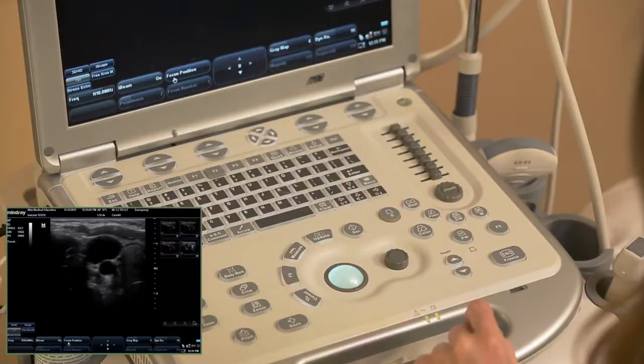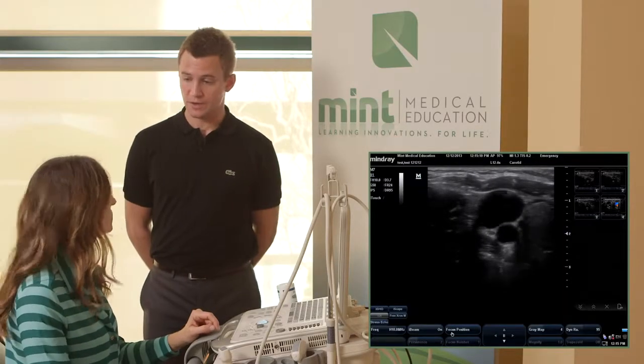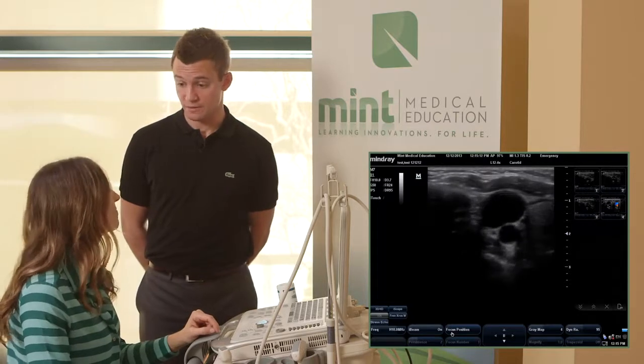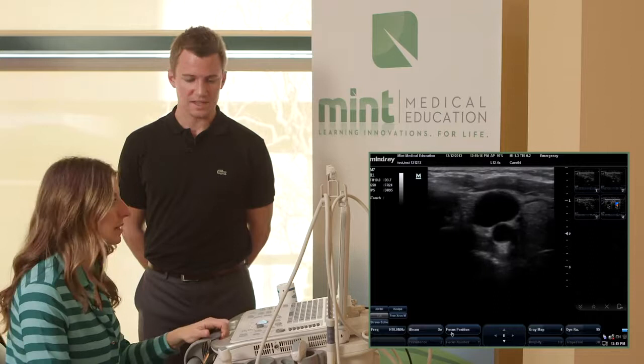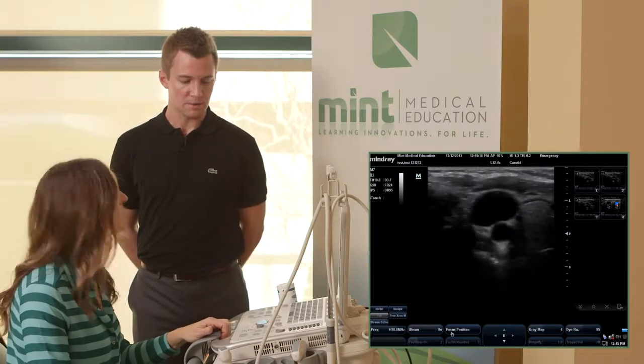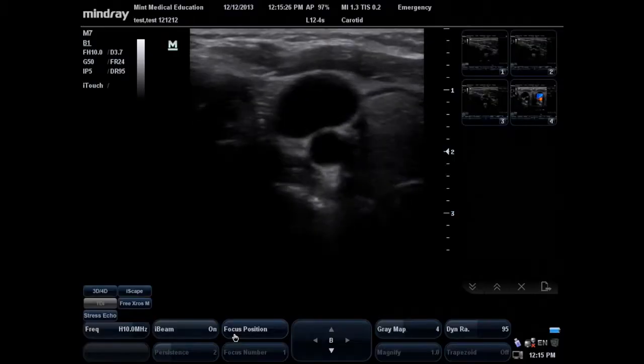Okay. And it's important to note that your power Doppler on the M7 is a very good tool for picking up sensitive low flow states. Right. Or deep, like a distal ICA or something where your color Doppler may not pack enough punch. Yep. That's good. That covers, I mean, most of the basic functions of color Doppler.